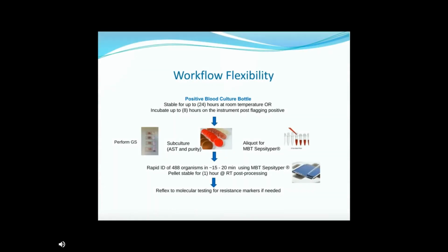So the workflow flexibility, again, the bottles are stable for 24 hours once they come off the instrument. So you have up to 24 hours to aliquot and run your Sepsityper. This is just how we do it here in our laboratory, and of course, from laboratory to laboratory, it can be used differently. But we perform our gram stain, we subculture it, and then we aliquot it for the Sepsityper.